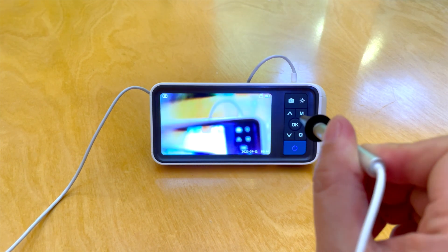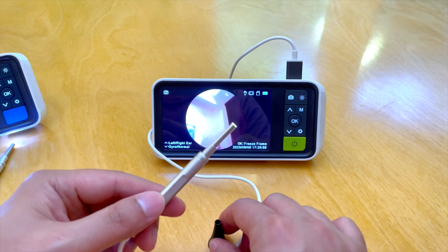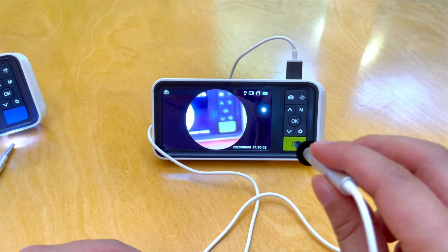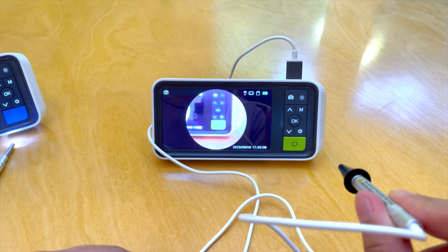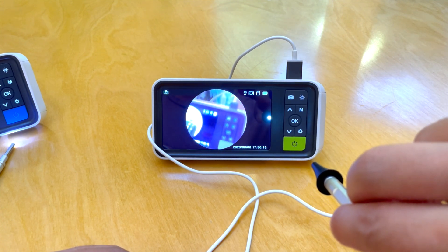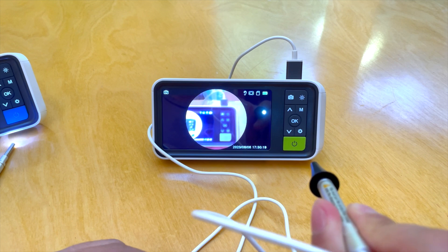The latest generation of digital otoscopes now includes gyroscopic control. No matter which way the camera is oriented, up will always remain up, or at least within a few degrees of true up, as can be shown here. This gyroscopic control eliminates the need for camera orientation prior to use, making the digital otoscope much easier to use.